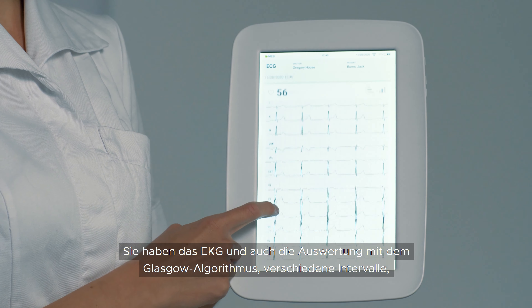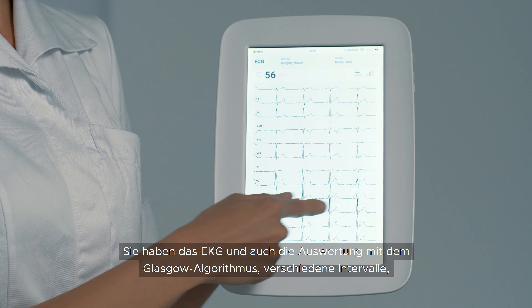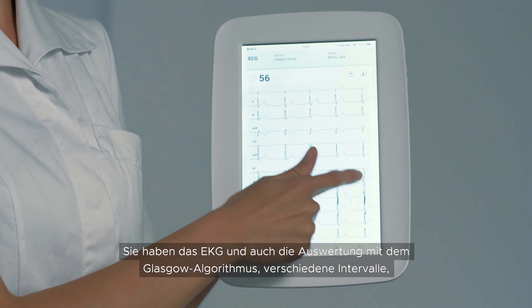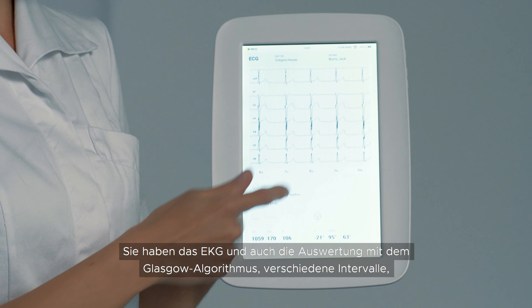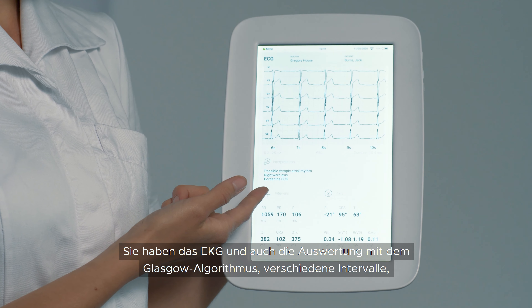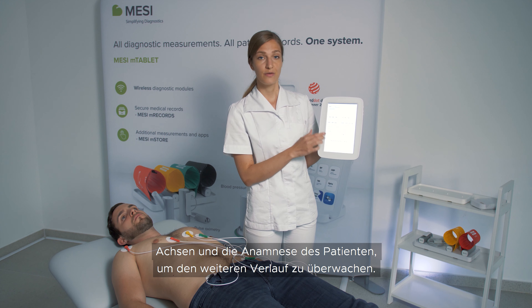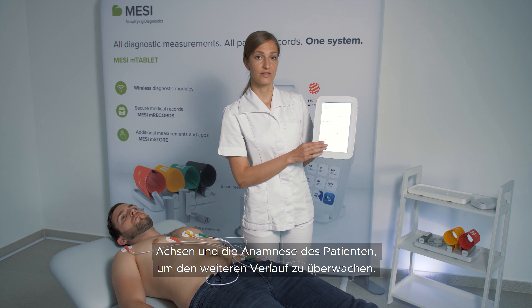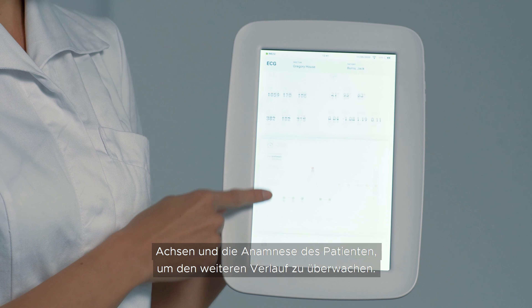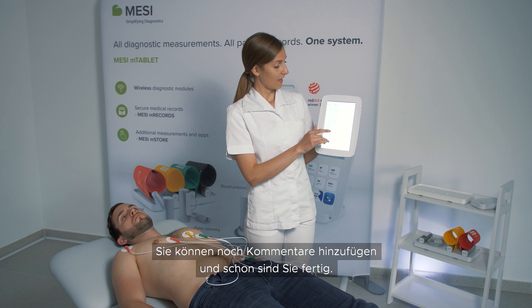You have the ECG, then you have the University of Glasgow algorithm interpretation. You have different intervals, axes, and you have the patient's history, so you can monitor the trends. You can add any comments and you're done.